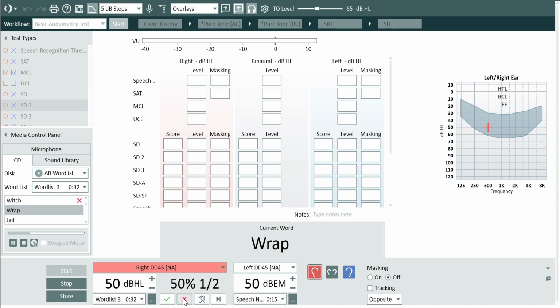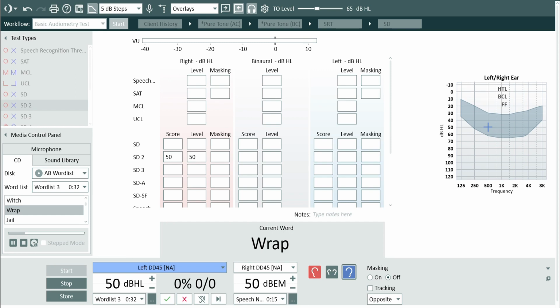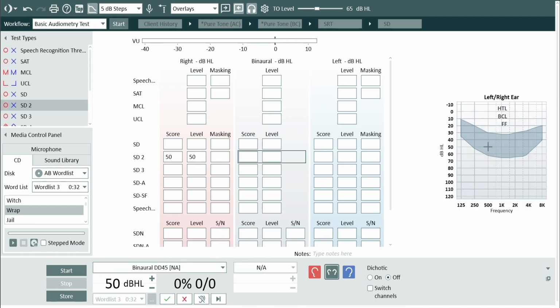To activate the microphone to communicate with a client, use F2 to talk over. The talk over function is indicated in the lower part of the screen. Talkback is always enabled by default, so you're always able to hear the client during testing. Level of talkback, talkover, and monitoring are found in the talk settings.